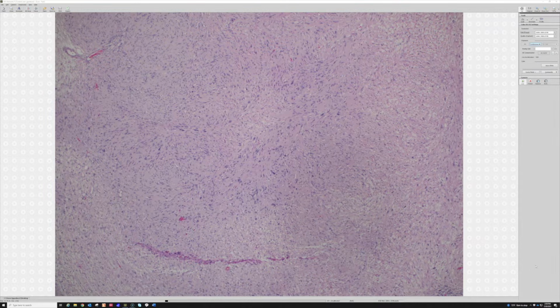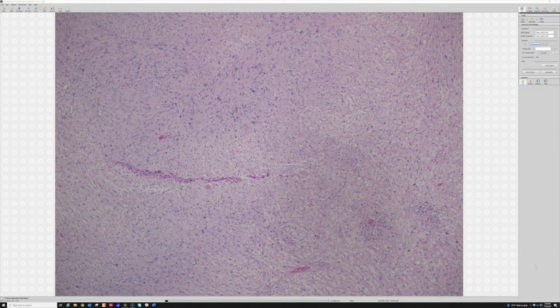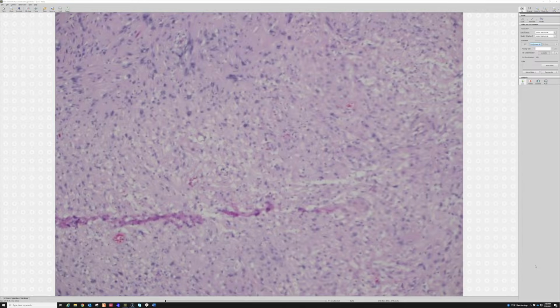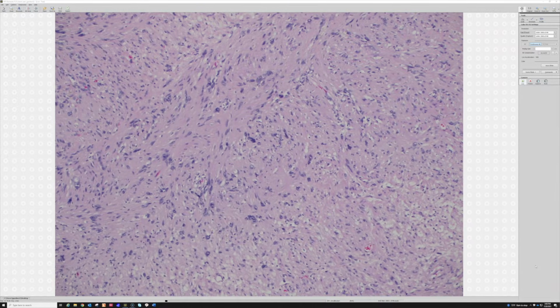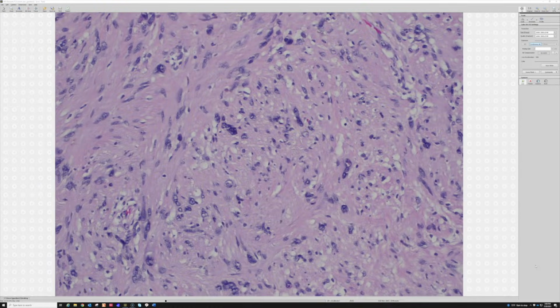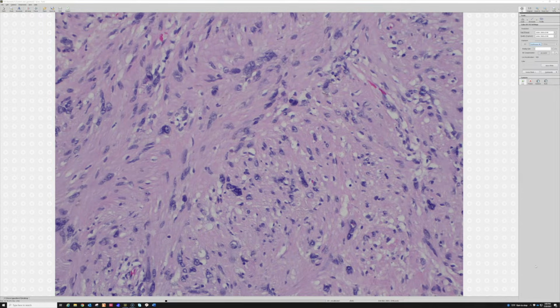And as they grow and get older, this is the theory at least, they can get some weird changes, what we call ancient change. Some of those are cystic blood-filled spaces, sclerotic hyalinized collagen, and scattered degenerative nuclear atypia, ugly pleomorphism scattered about. Oh, look. This one doesn't have the sclerosis and blood-filled spaces so much, but it does have the scattered degenerative atypia, or ancient atypia.